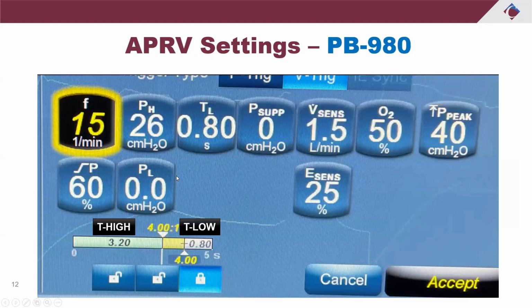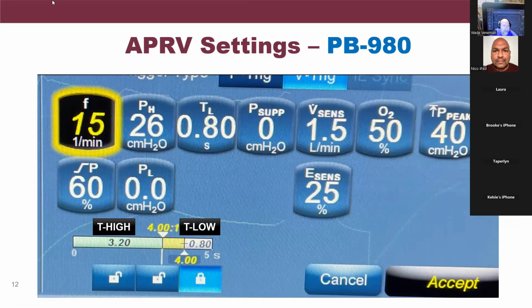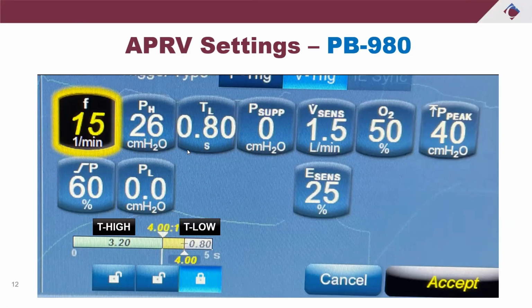If we look at the 980, it's a little bit trickier. So for those of you at Clovis that are on, hang on here with me for a minute and see if I can get this down right so you can get an idea of what I'm trying to explain. When you're looking at this window, this is an I:E ratio or total respiratory cycle time, whatever they call it, it's more like a total cycle time here. You have three options down here in this window. You have your long bar here, the green bar 3.20. That would be considered your time high, and that's associated with this first lock. The middle one is your I:E ratio associated with the middle lock, and then your time low is going to be the far one. And you notice this one is locked here.